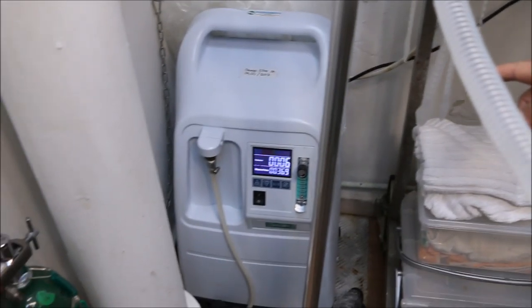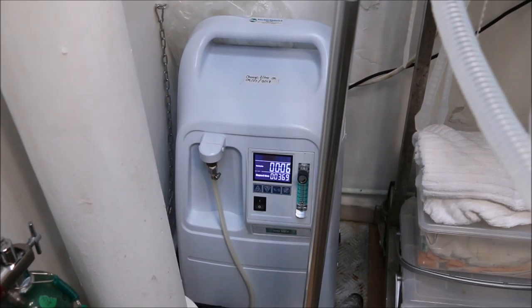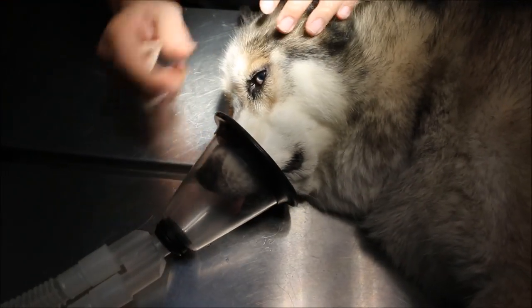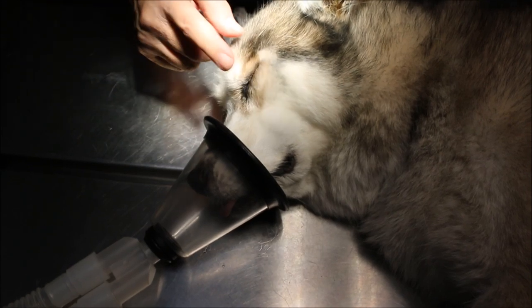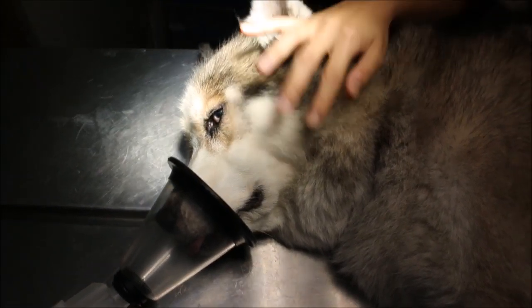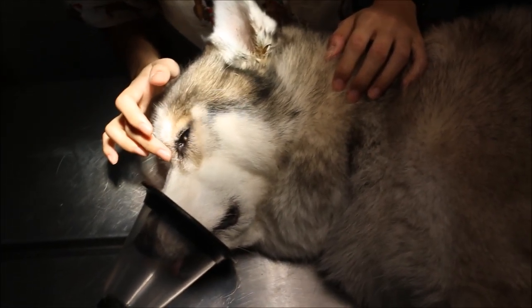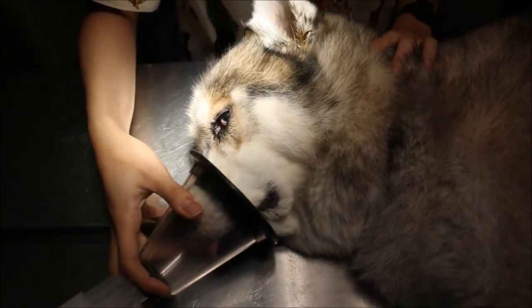There is an oxygen generator that generates oxygen from the air rather than a cylinder. Now we will put the cone on, then check the blinking reflex. Once the blinking reflex is gone, I will do the ear irrigation.